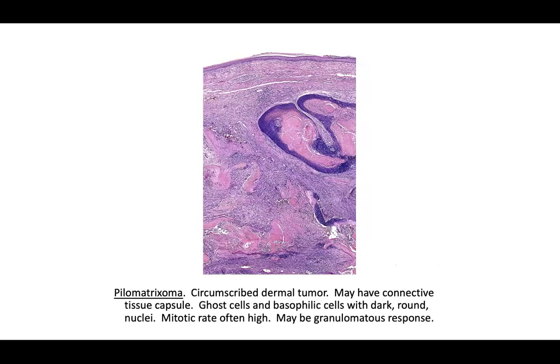What's your differential diagnosis? Pilomatricoma often has rims of very deep blue basaloid cells and adjacent areas of acellular eosinophilic skeletons of previous cells. Those are often referred to as ghost cells. A little Halloween theme for you. The ghost cells are pretty spooky, but when you see them, they're actually quite definitive for this diagnosis.